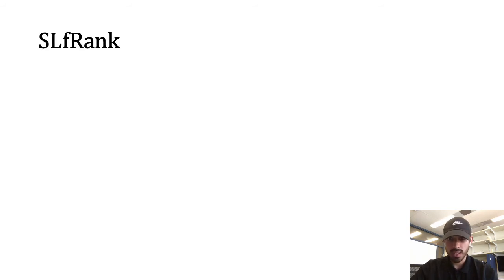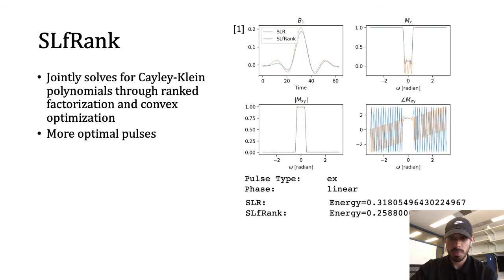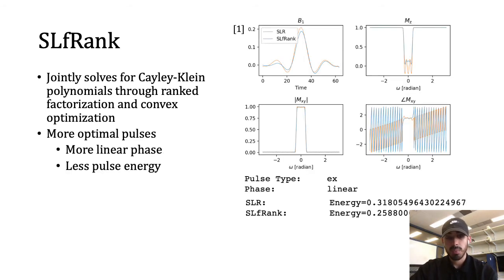This joint solving that I was talking about is introduced through SLfRank, which was a paper published by Frank Ong in March of 2021. It jointly solved the parameters through convex optimization and rank factorization, and results in more optimal pulses with more linear phase and less pulse energy.